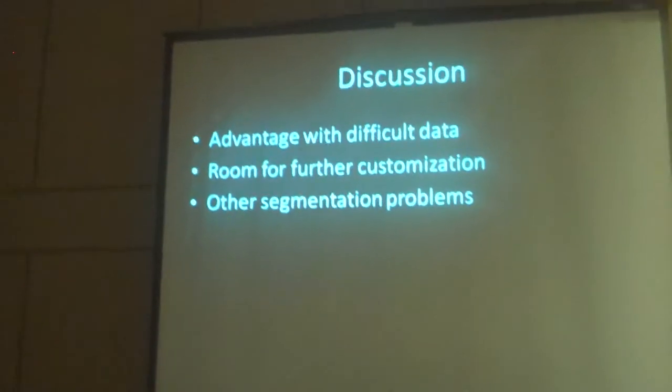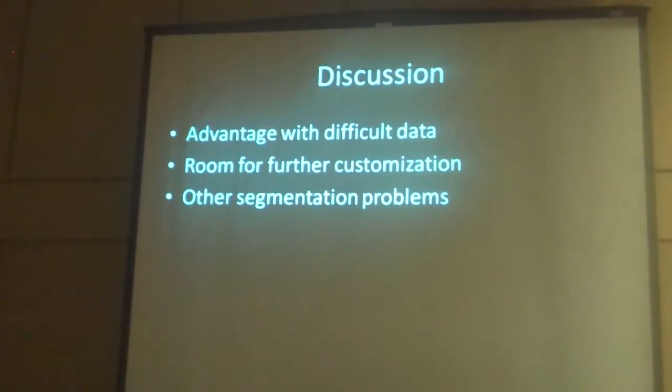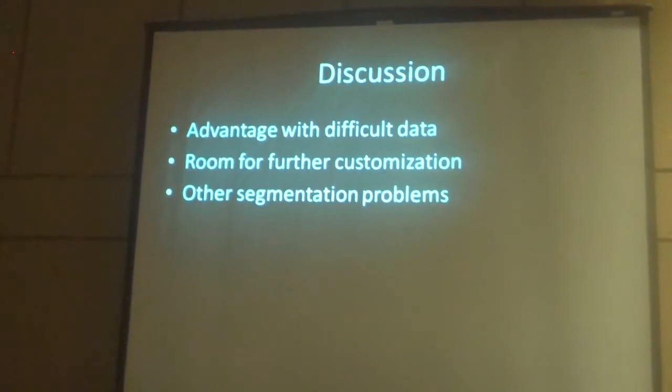Organisms that look for features specific to, and only included in, your data. If you have tumors in your data, you can have an organism specifically look for those boundaries, and other organisms can use that information to help with their own tasks. And this framework is generalizable to any type of medical imaging task or any type of segmentation task in general.